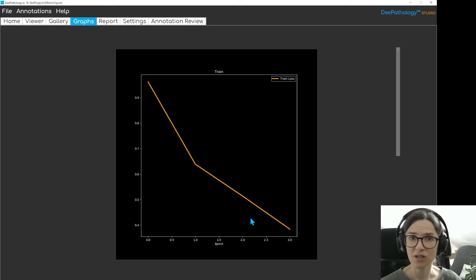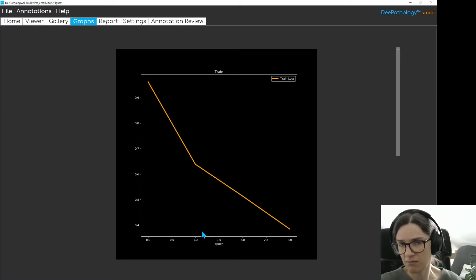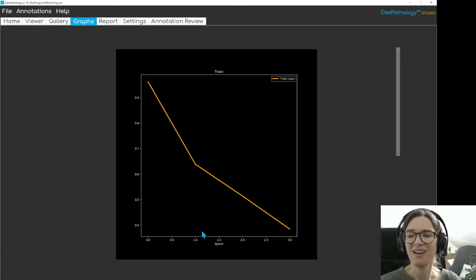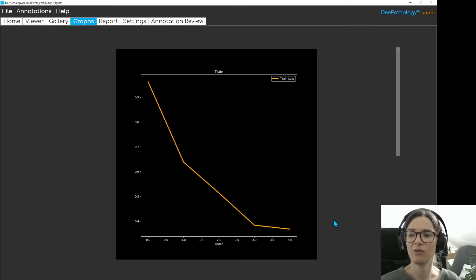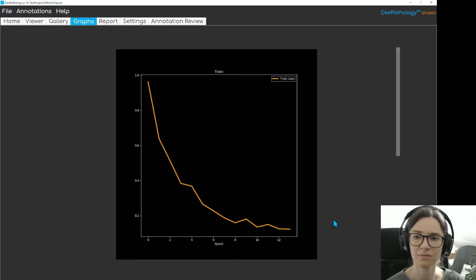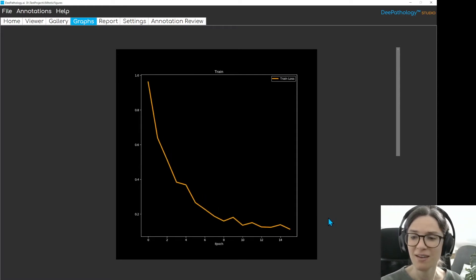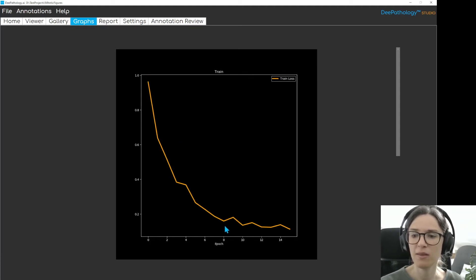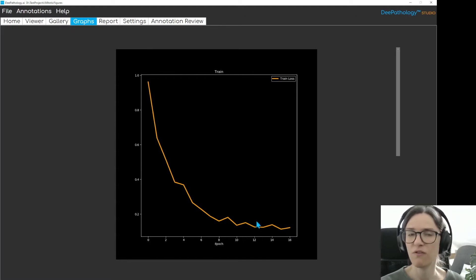I will watch the train loss a little bit, and once it has come closer to zero — which would mean that it makes zero mistakes — I will go back and make some more annotations. After a very steep improvement in the beginning, the train loss curve has now somewhat flattened out, which means it's a good time to become active again.